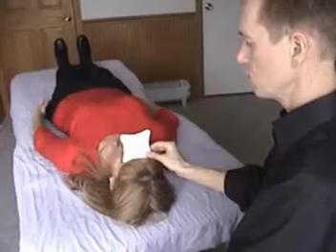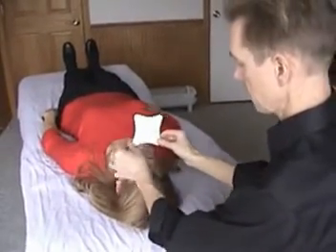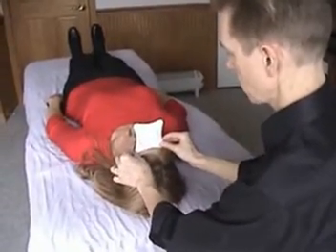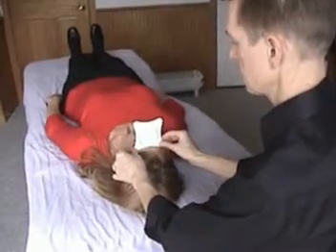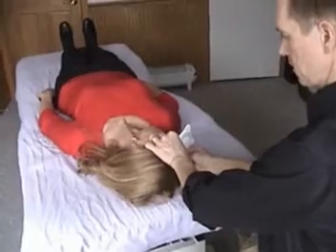Now to do cervical rotation, the inclinometer will fit right across the forehead. It's all the same principles. When the person rotates to the right, just follow the numbers and read the numbers.